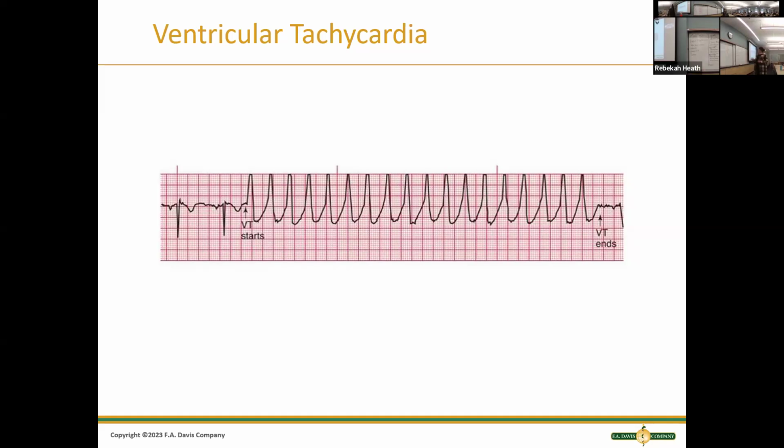What about the QRS complex? Is that nice and tidy or is it wide? It's wide. So we know since it's wide, it's coming from the ventricles. How fast is that right here? Well, I do about 18, just right on here on part of the 6-second strip.